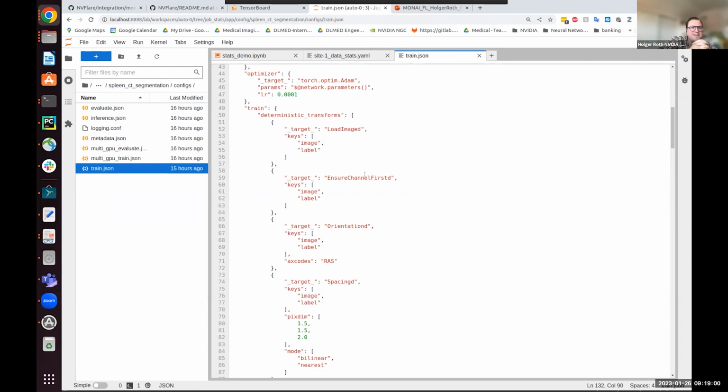I just wanted to mention that we also have examples where you can stream TensorBoard events to the server. Of course, there are some privacy concerns related to that. So maybe sending the segmentation mask to the server is fine in certain settings, but you don't want to stream the original data, right? So this needs to be carefully handled, and the code might need to be approved by the clients for doing this.